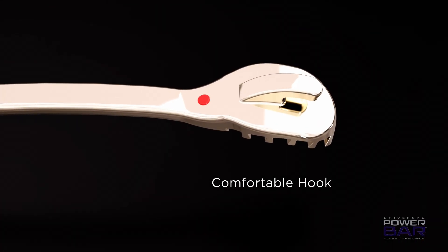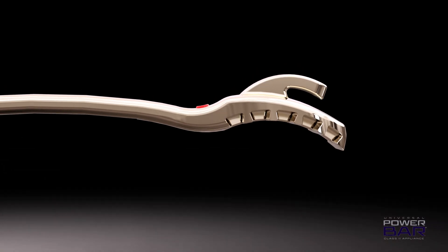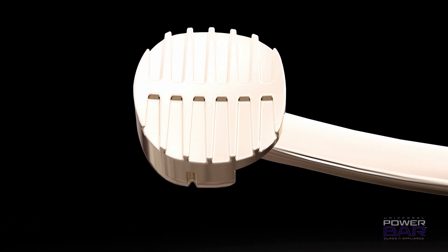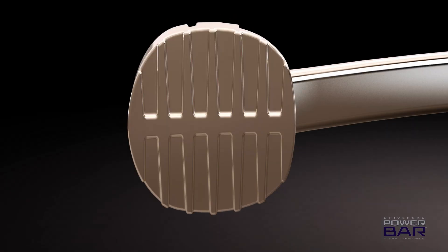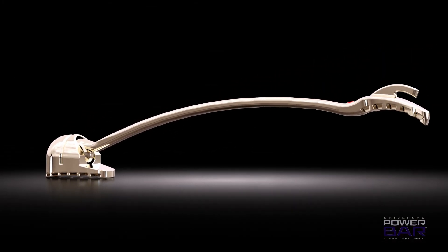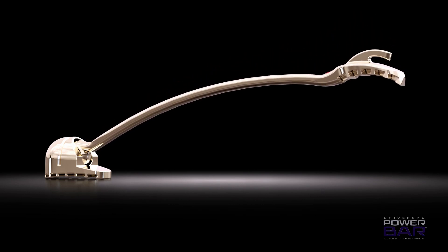The mesial hook is designed to be comfortable while providing easier elastic placement for the patient. The patent-pending pads feature undercuts for maximum bonding strength. The distal socket has a facial line that provides a visible sight line for placing on the molar buccal groove. The ball and socket design allows free movement of the bar for rotational control of molars during treatment.